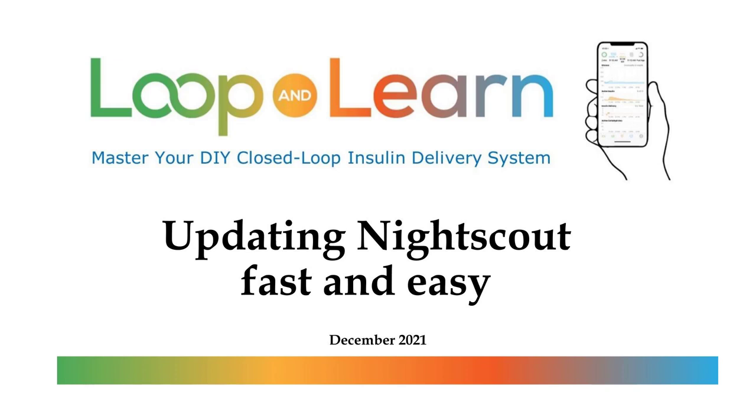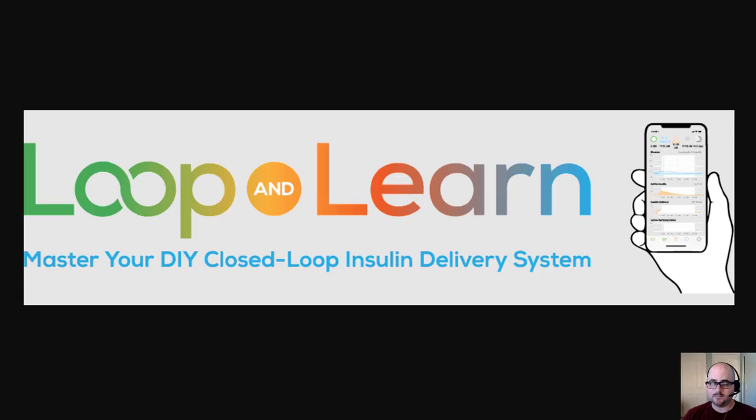Hello, welcome to Loop and Learn. I'm going to walk you through how to update your NightScout site.